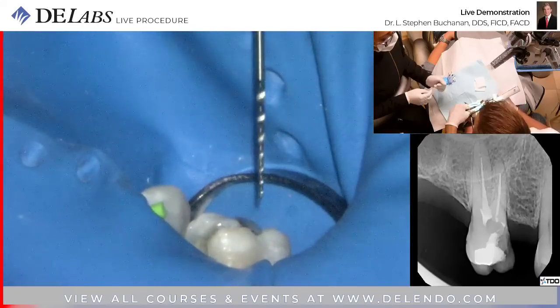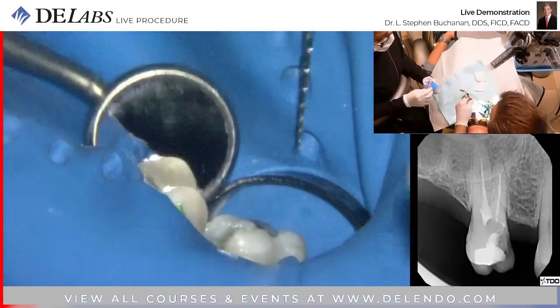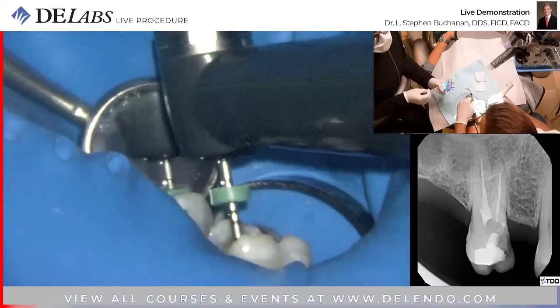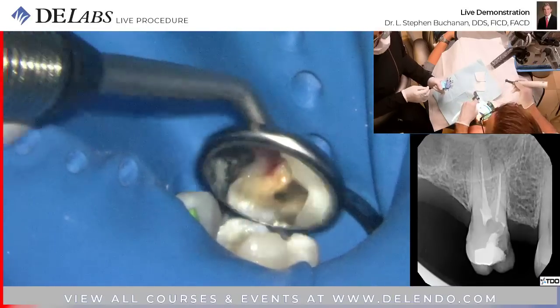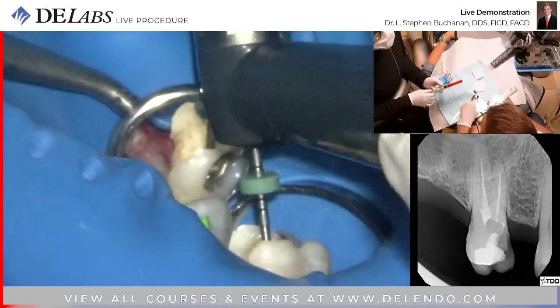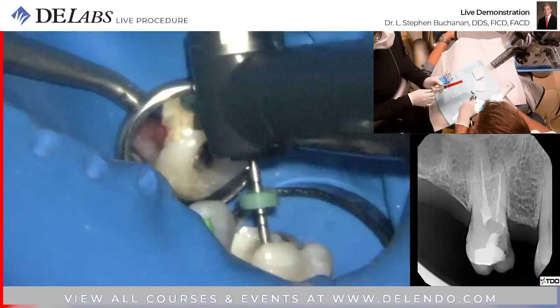Yeah, good thing I used the 30 because this isn't cutting that easily. Instead of a 40, you mean, or it's a good thing you used a 30? I used the 40 to open up some space in there. Are we dry again? No, we're okay. Actually, the 20 went through and the 30 fit short. And then I cut the 30 to length. This is not when I put the 40 in, I don't believe.